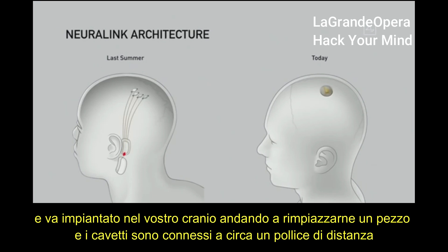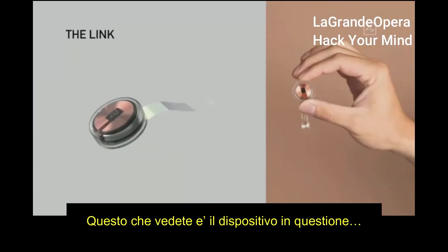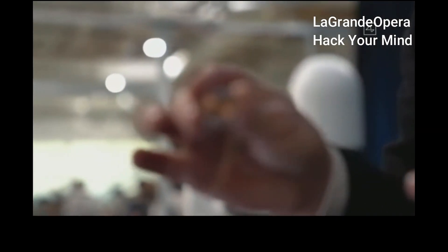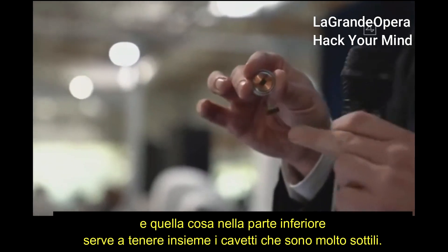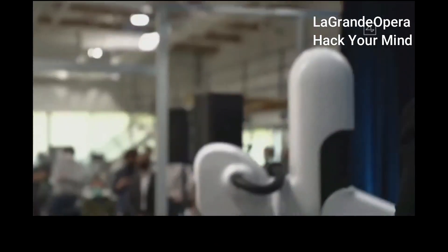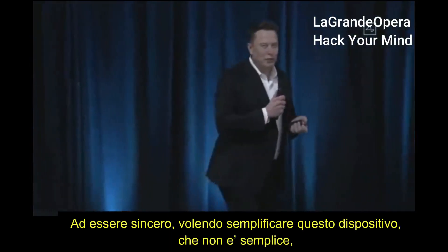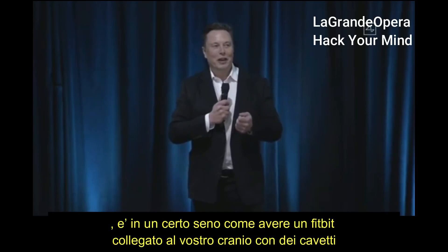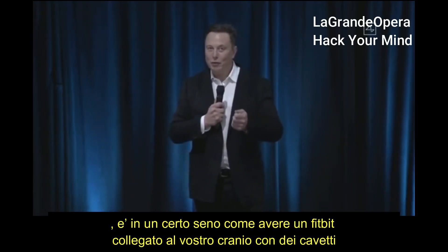The wires connect within a few centimeters or about an inch away from the device. That little device — the thing at the bottom is just to hold the threads in place because they're just like little fine wires. To simplify: it's more complicated than this, but in a lot of ways it's kind of like a Fitbit in your skull with tiny wires.